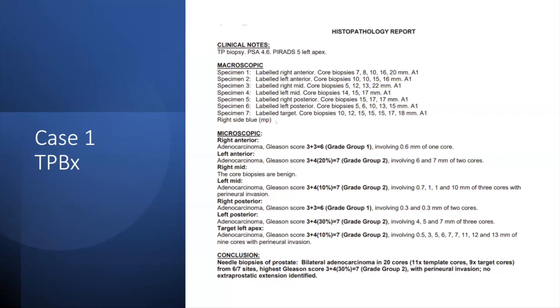Okay, thank you. Now, question for you, Veeru. In terms of biopsies, is it the urologists who do the biopsies in your centre? Mainly the urologists, but we do have the radiologists doing some as well. Okay, and I guess just briefly, how do you do it? So we do transperineal, targeted plus or minus systematic biopsies. We don't use fusion software. We've developed an in-house fusion software over the years with a trial we've been running, but we find with visually registered good transperineal biopsy, we get relatively good detection rates. So we're happy to stick with that.